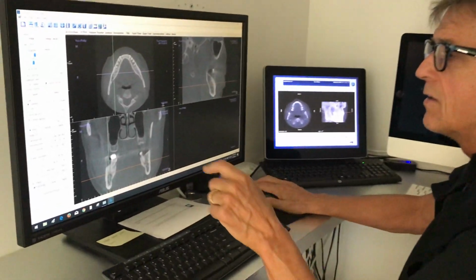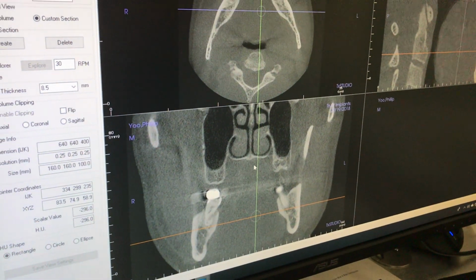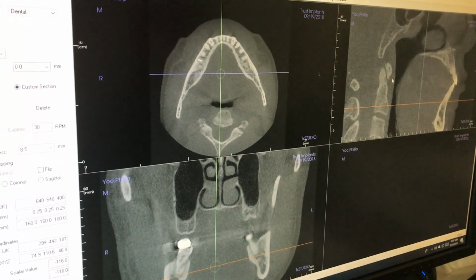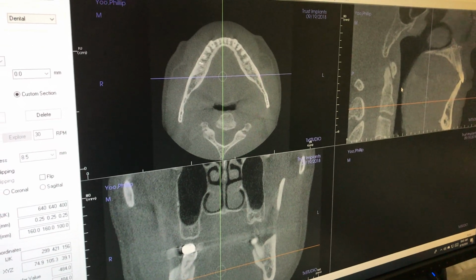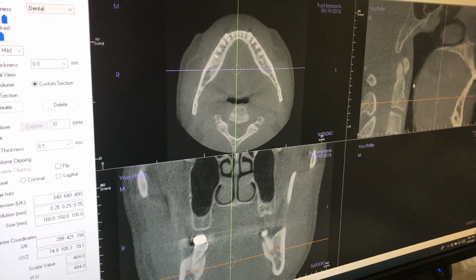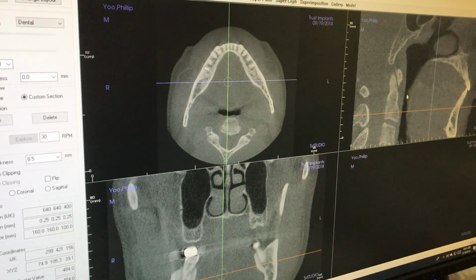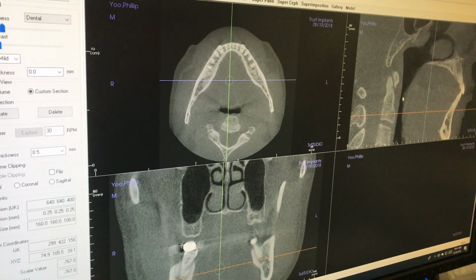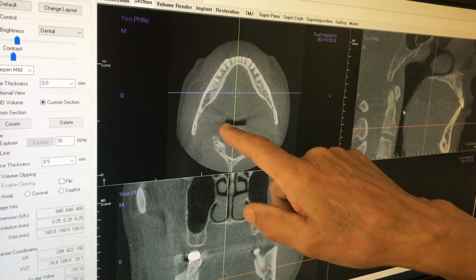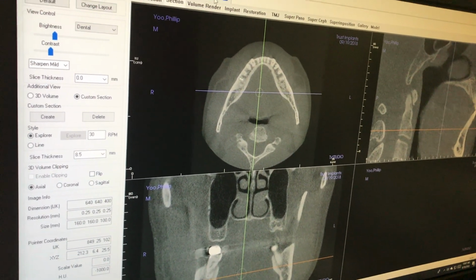Yep. Okay, now let's look at your throat from the side, and you can see right there. That's your choke point, and that's with you vertical. Imagine what happens when you relax and your tongue falls back in your throat. So I can predict that you have apneic events just based on the size of this and the size of this. And we have a little tool here that we can do.